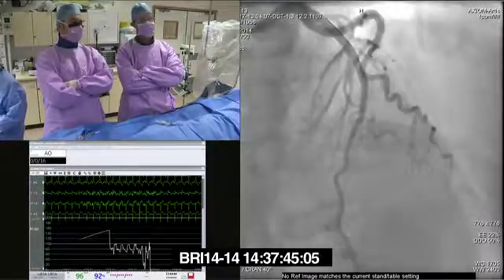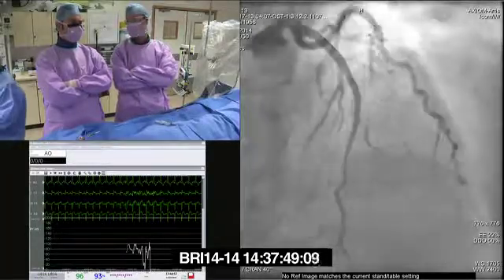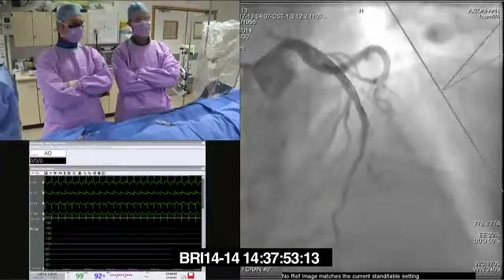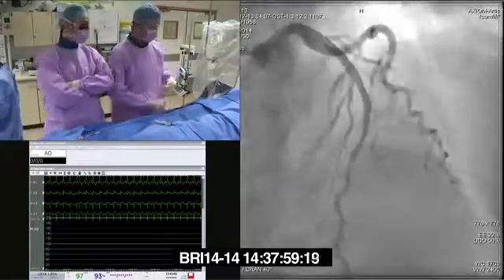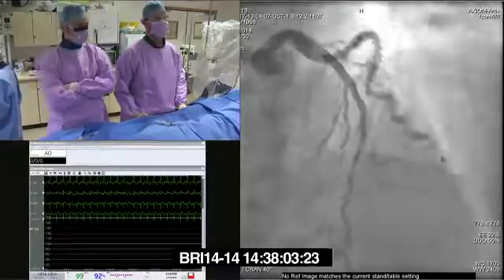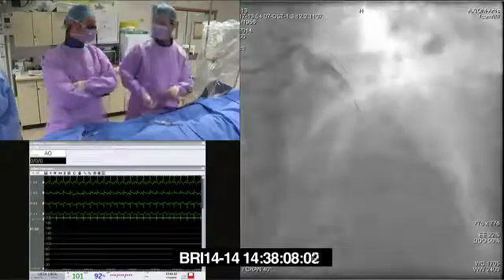I'm going to stop there. The indication was debatable, and I don't want to make any further damage. We've got TIMI 3 flow. We've come in, done what we wanted to, and we also had the option to go back. Happy with that? Yes, so she's going back to CCU. She's going to have the full assessment, including an echocardiogram today. We're going to monitor vital signs and symptoms. Perfect. Thanks very much.